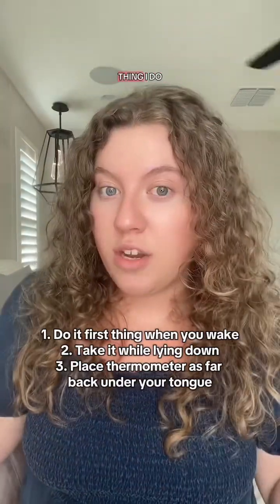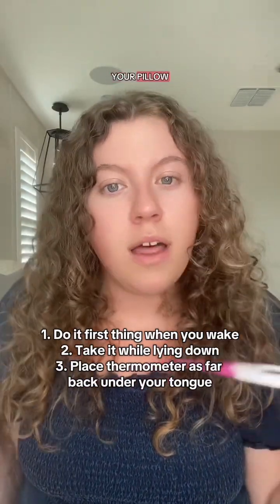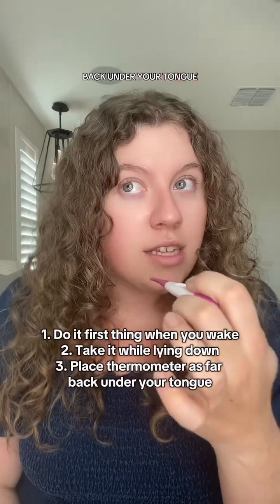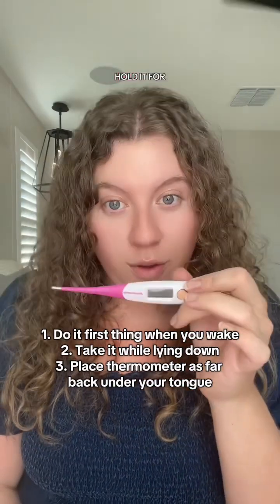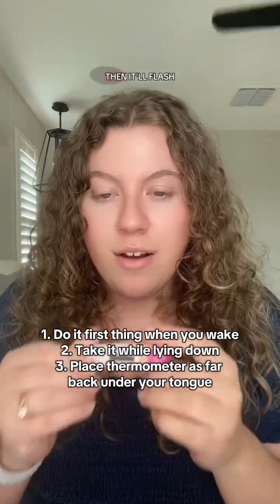And in the morning, the first thing I do when I wake up, I don't get out of bed, I just reach over to my nightstand, grab this, or you can even place it under your pillow, stick it in your mouth way back under your tongue, as far back as you can go, press the button, wait like 30 seconds, wait for it to beep, and then it'll flash the temperature, and you input it into this app that is through Natural Cycles, but I know there's other apps you can use too. And you input what the temperature says, and then it calculates where you're at in your cycle based on that.